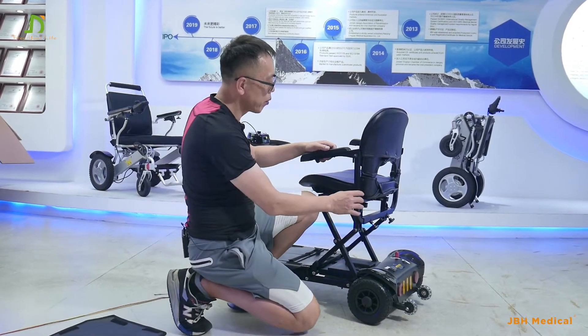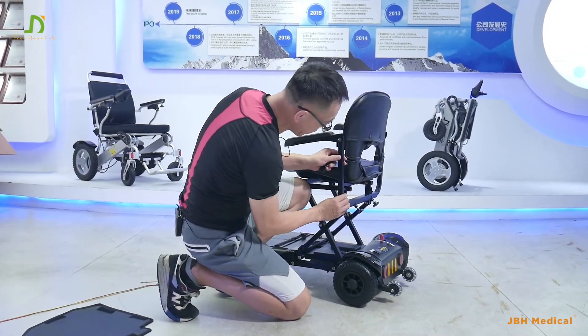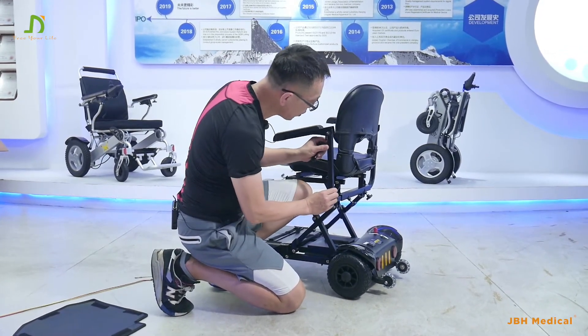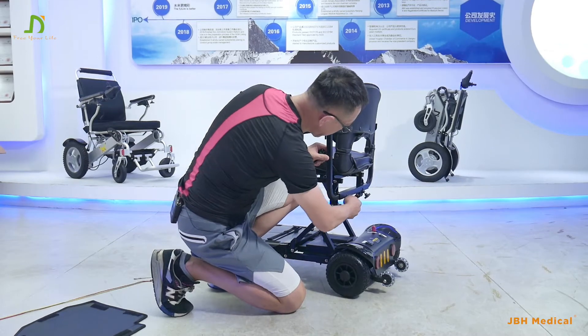We can adjust the width of the armrest by turning the knob here. Pull out the armrest, then pull it to your suitable position and lock it back. Same way on this side.